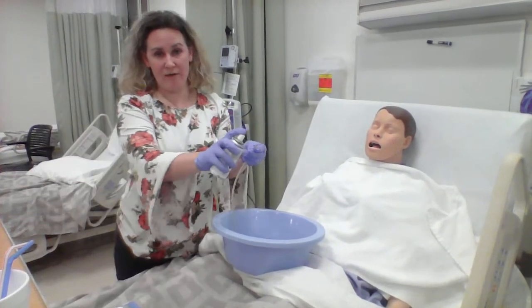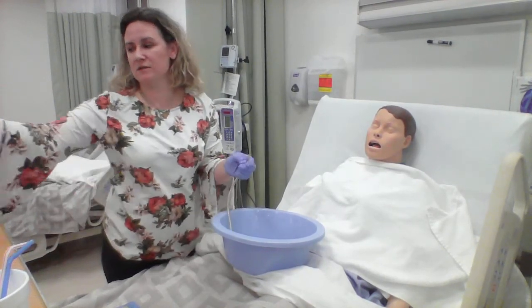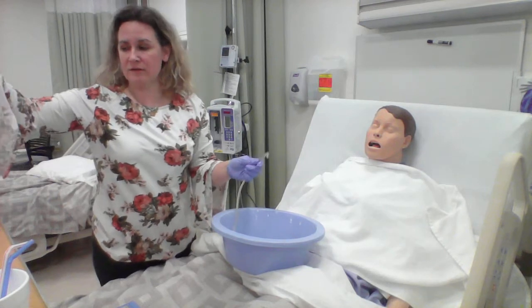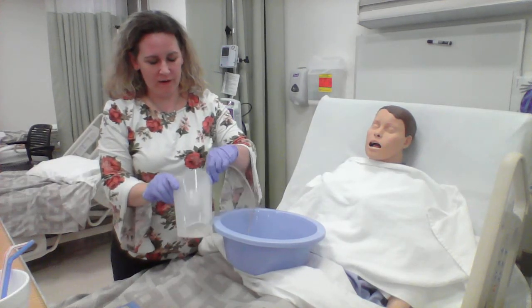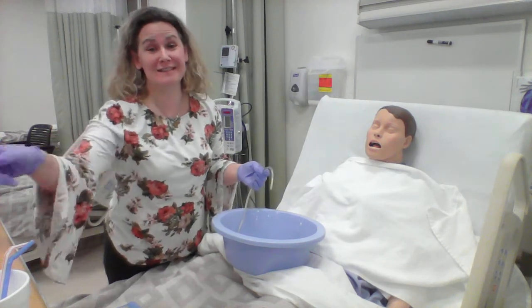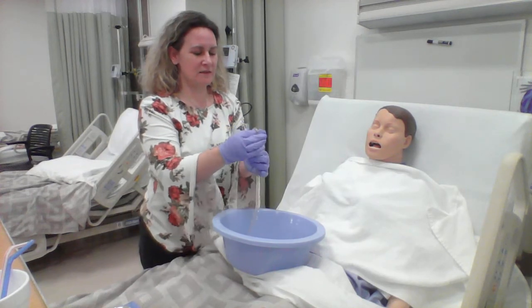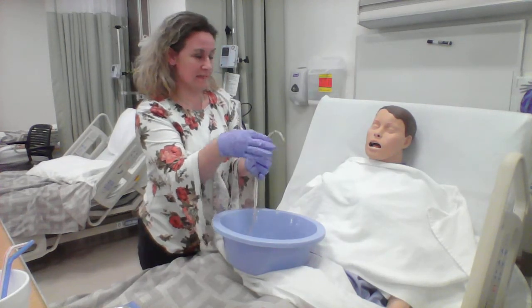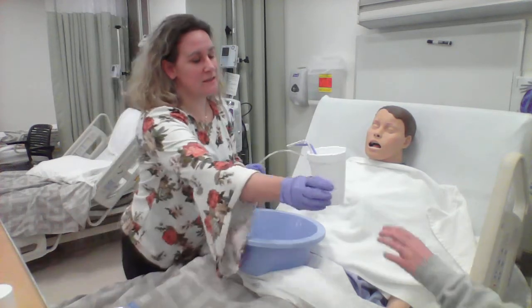So we're going to go ahead and lubricate it, which we already have, and this is a spray lubricant for mannequins. Other lubrications would be different for humans. And then we're going to dip this in water to just add more lubrication, as the checklist says. Then we're going to curl the end a little bit so that it goes down a little bit easier. And we're going to have a secondary nurse that's going to help me.